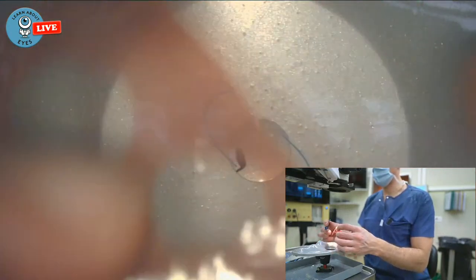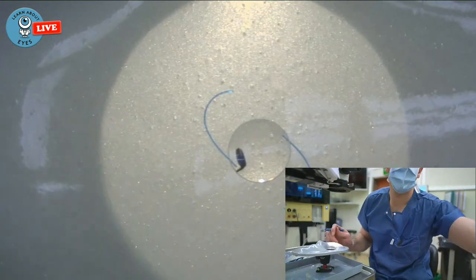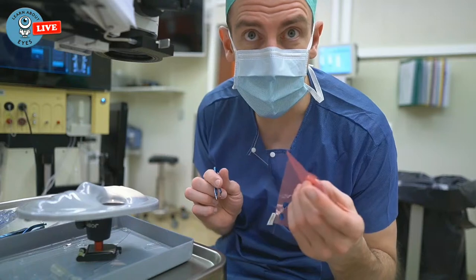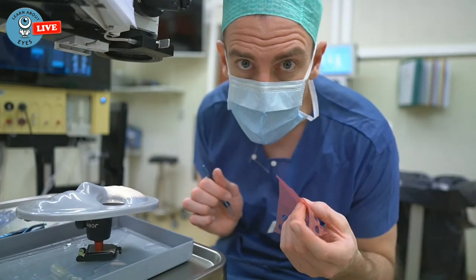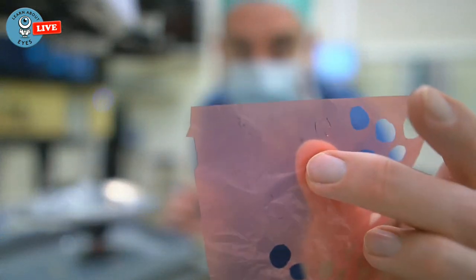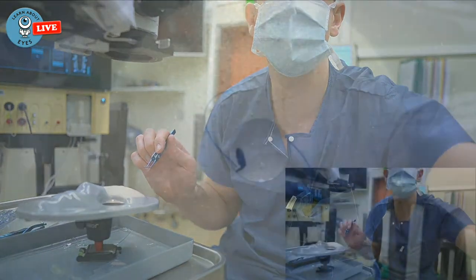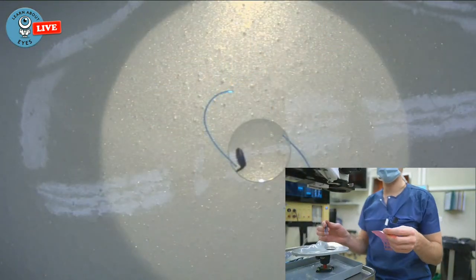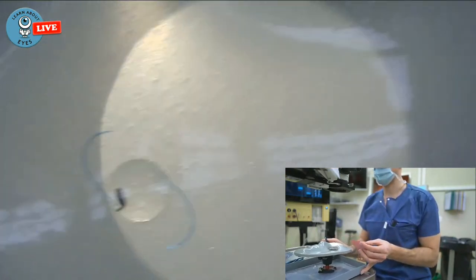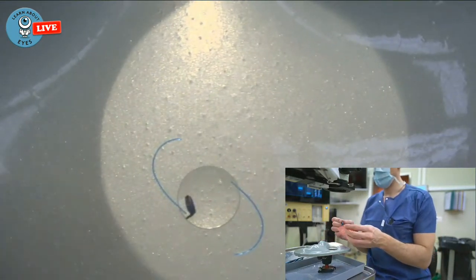So everybody who just tuned in, I'm trying to create an eye that you can use to practice your YAG capsulotomy. So I'm trying to find a way to stick this thin foil to this three-piece lens and then implant it into this eye so that one of my residents can practice with it. Okay. So, new idea.